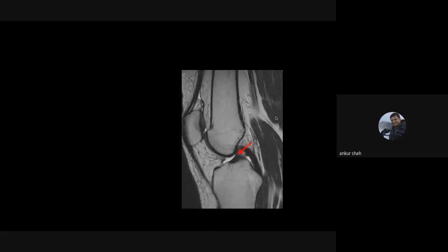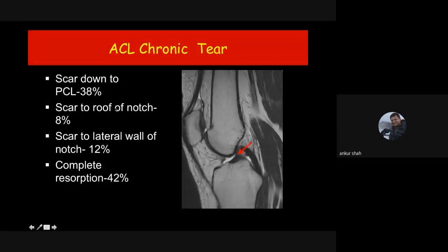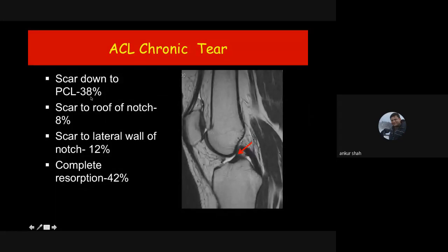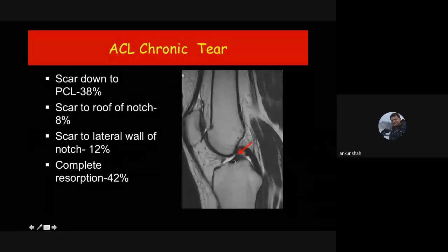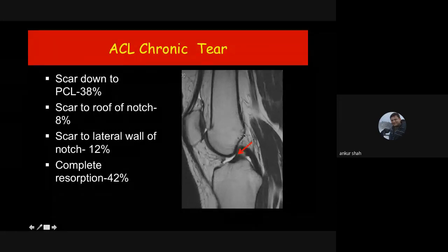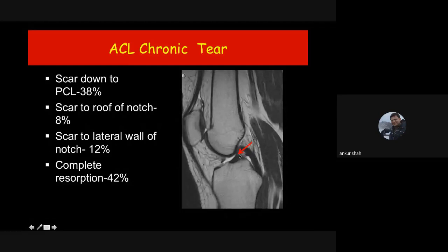What happens when a torn ACL is not repaired? In about 38% of cases it scars down to the posterior cruciate ligament; in about 42% there is complete resorption of the ligament. In about 20% of cases the ligament scars down to the roof or lateral wall of the intercondylar region, making it extremely difficult on MRI to identify as a torn ligament. Unless we have a previous MRI to compare, detection is very difficult. The only finding on MRI may be a relatively smaller or thinner ligament compared to the PCL.